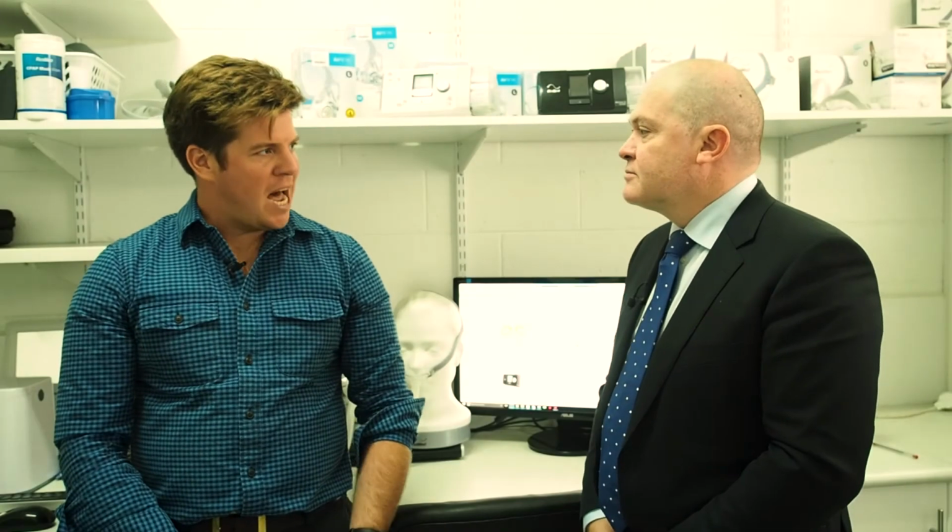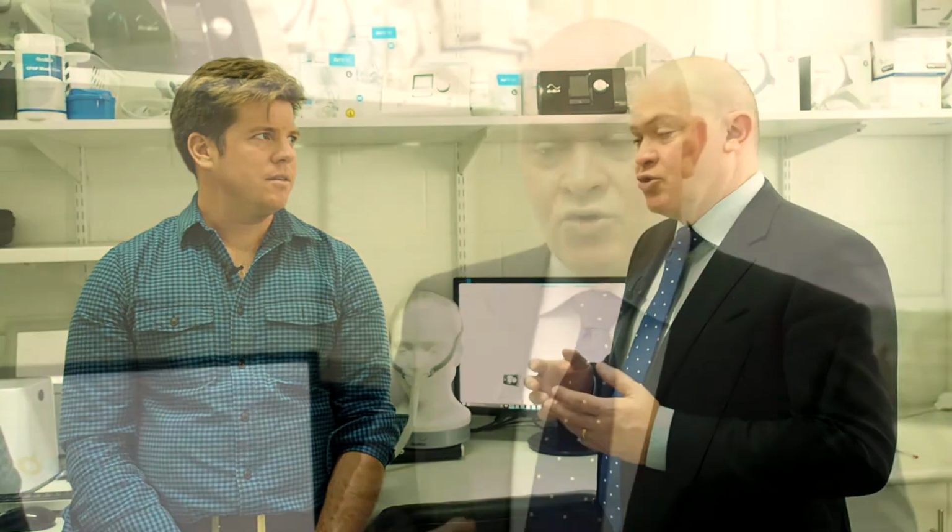Following on from that, what can't you tell from a sleep study? A sleep study doesn't replace a consultation. Sure, I can measure how often someone has trouble with breathing during sleep or how long they've slept, but I can't tell why someone might be tired, or what might be disturbing them during the night, because that really involves talking to somebody and taking a clinical assessment. If I take a clinical assessment and pair that with a sleep study, that's what helps me to answer those questions. Sleep studies are great for answering how bad is my sleep apnea, do I have it, but not necessarily why am I tired.